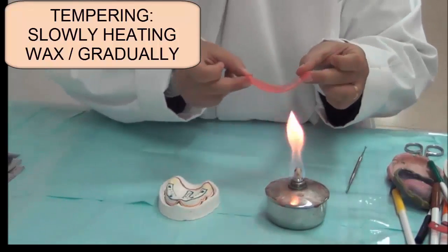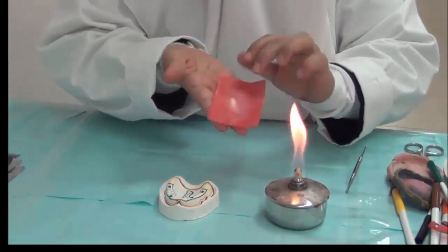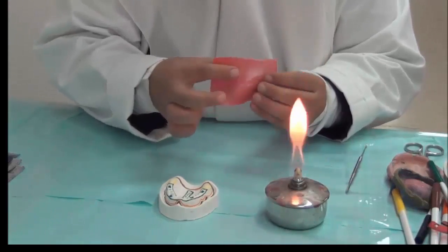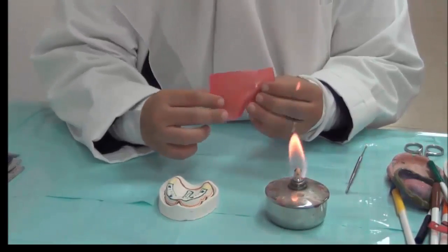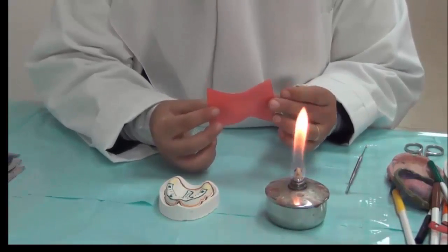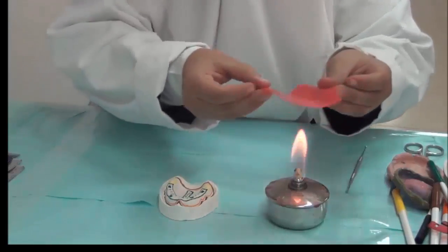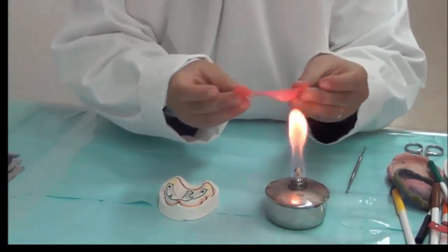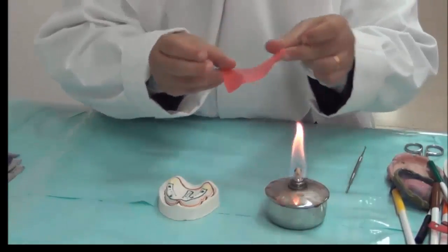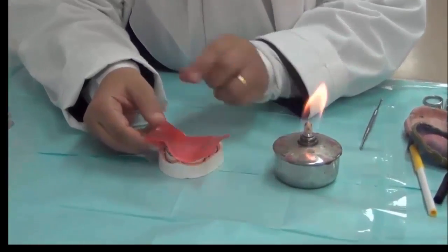So we go in and out, in and out. Going in on the temperature heats the surface. When we go out, we allow sufficient time for the heat to diffuse to the inside. Wax is not a good thermally conductive material, so we need time for the heat to diffuse from the surface to the inside. So we heat it gradually. This is called tempering, using dry flame. And once it's soft enough, we just put it on the cast and begin adapting it.